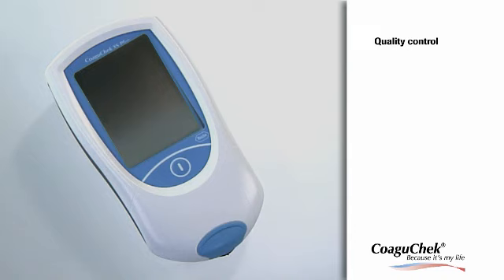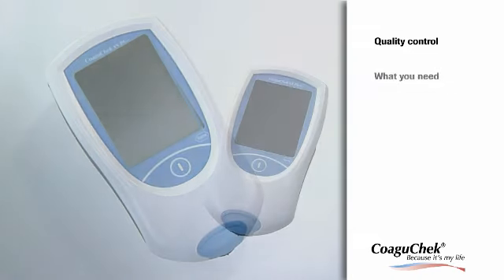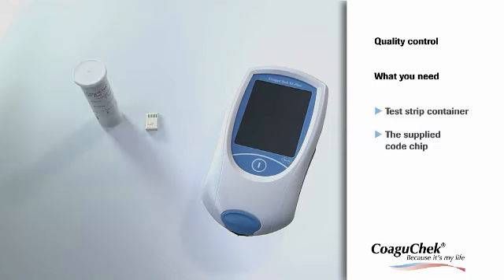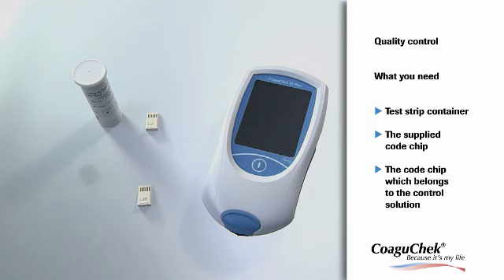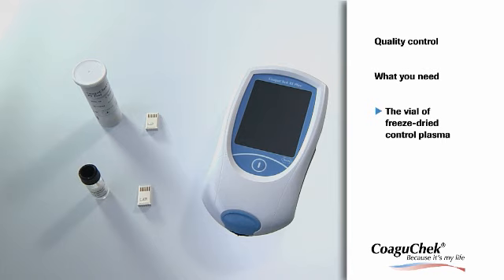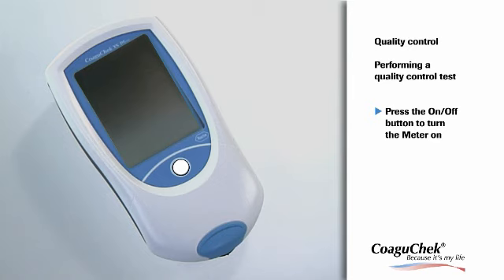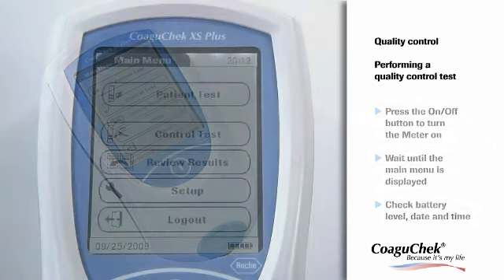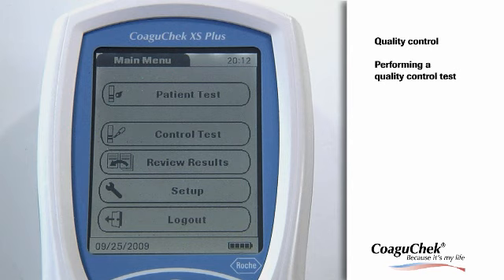Your Coagichek XS Plus meter has several automatic self-checks for meter and strips to ensure maximum quality results. If required, you have the option to perform liquid quality control tests. To perform quality control tests with the Coagichek XS PT control solution, you need: the code chip supplied with the test strip container you are using, the code chip belonging to the control solution, the vial of Coagichek XS PT control plasma, and the diluent-filled pipette to prepare the control solution. Press the On-Off button to turn the meter on. Wait until the main menu is displayed and then check the battery level, date and time. After you have prepared the control solution, you can perform a quality control test.